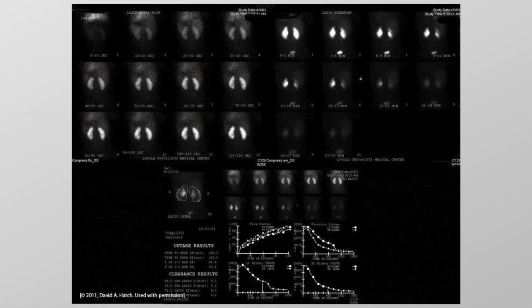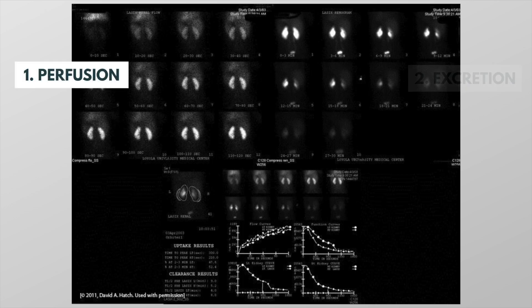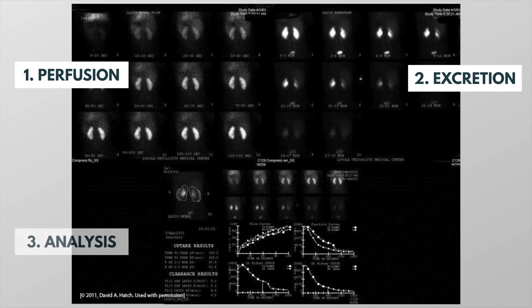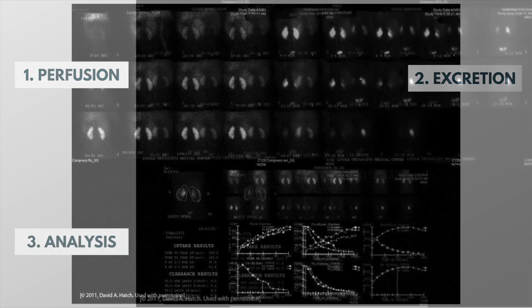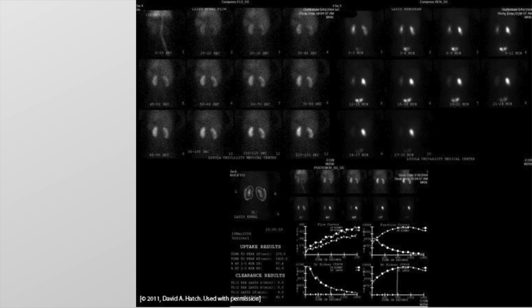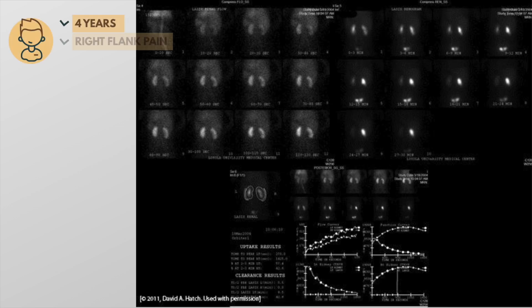The scans you will read will vary in appearance, but you should see three image panels: a perfusion panel, an excretion panel, and an analysis panel. Here's a renogram from a 4-year-old boy referred for evaluation of right flank pain. A previous ultrasound showed grade 4 hydronephrosis of the right kidney. We suspect an obstruction, but we need to confirm this.